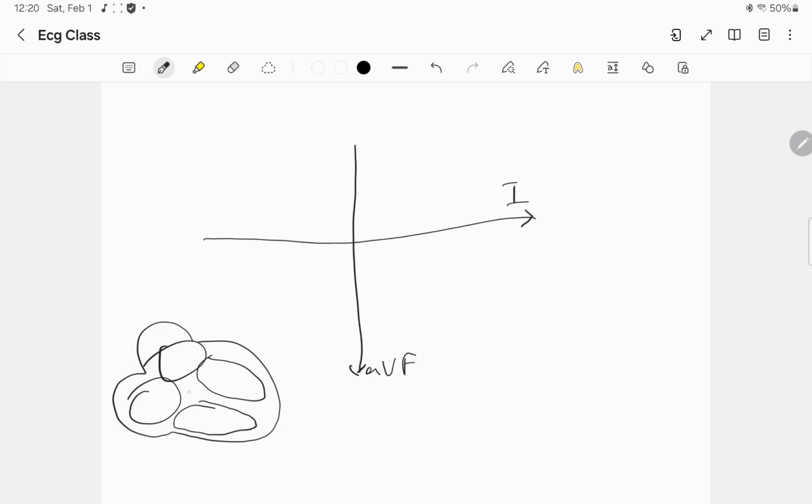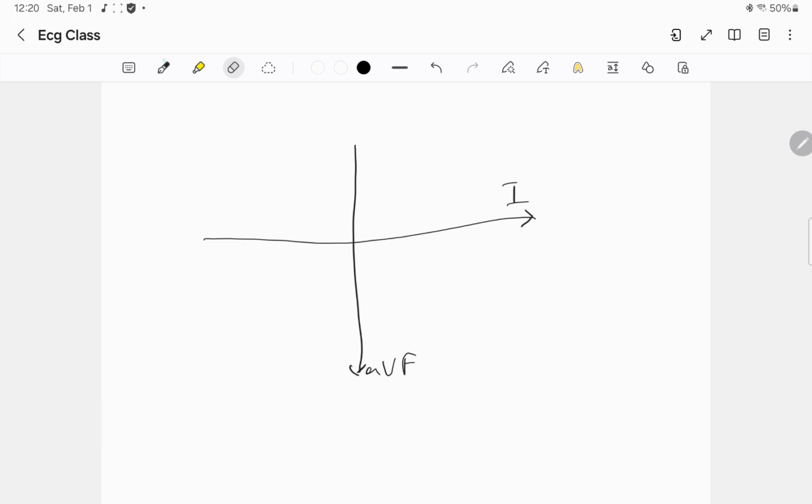We're going to be focusing on the electrical impulses of the ventricles and what is the mean. So when all of those impulses are summated, what is the average direction of that force? In prior ECG videos, we would have mentioned that the mean electrical vector is approximately 60 degrees. Anyhow, let's get back to this quadrant diagram.